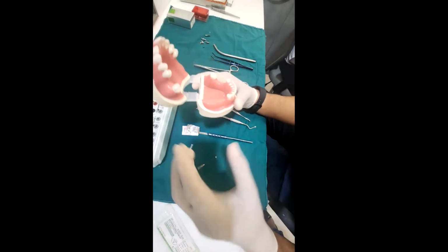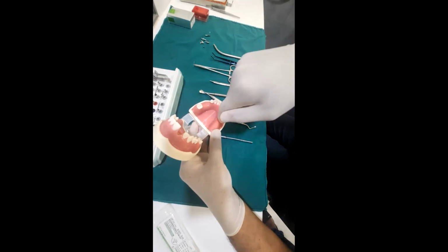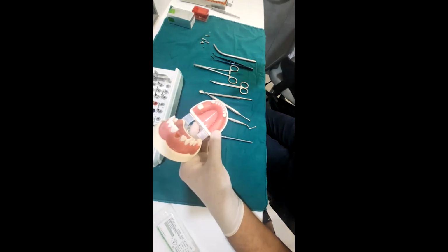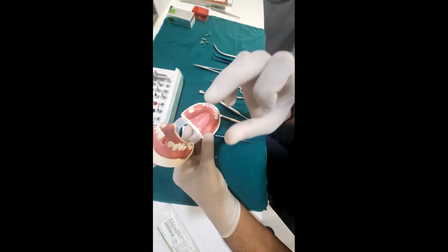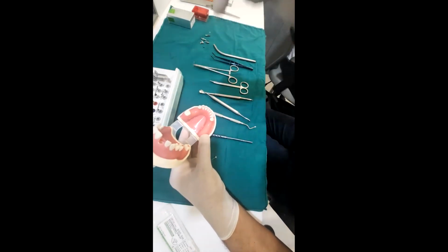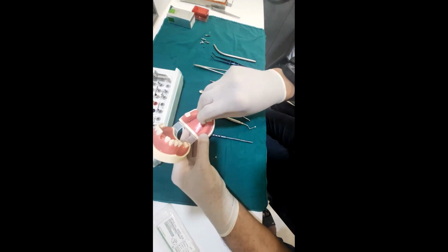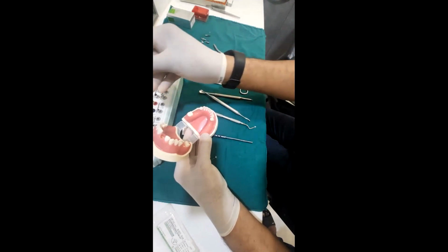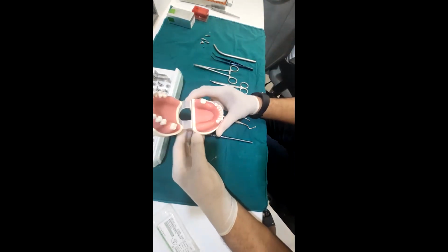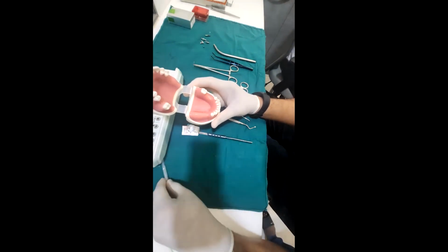When you have your plaster model, then you know that cervical buccally I have about 4 millimeters, or on the crest I have about 3 millimeters of soft tissue. So if your X-ray is showing say 10 millimeters of bone and you have about 3 millimeters of soft tissue, then when you are placing using your drill, you need to know that you will need to go about 13 millimeters to reach the 10 millimeter depth. So this is how bone mapping can help in the first few cases till you get the hang of implant dentistry, doing a regular implant.